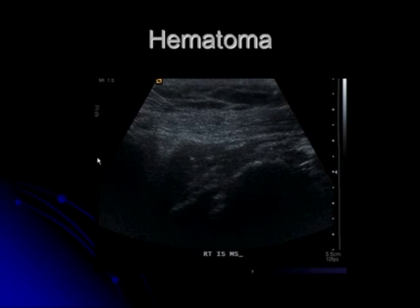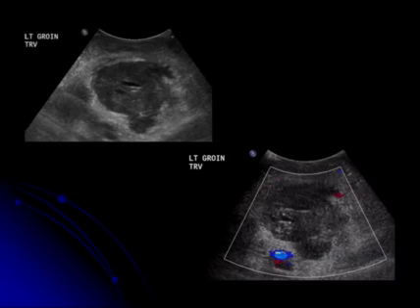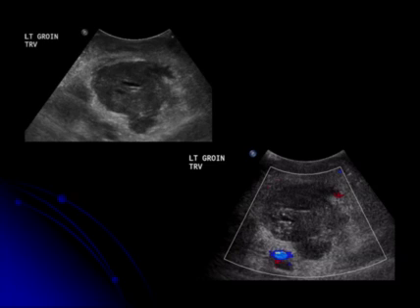The other part of muscular injuries deals with muscular hematomas. This is a demonstration of an intramuscular hematoma — a lobulated hypoechoic lesion within the muscular planes. On color Doppler, there is no vascularity within the lesion. This is consistent with a hematoma given the background history of injury.